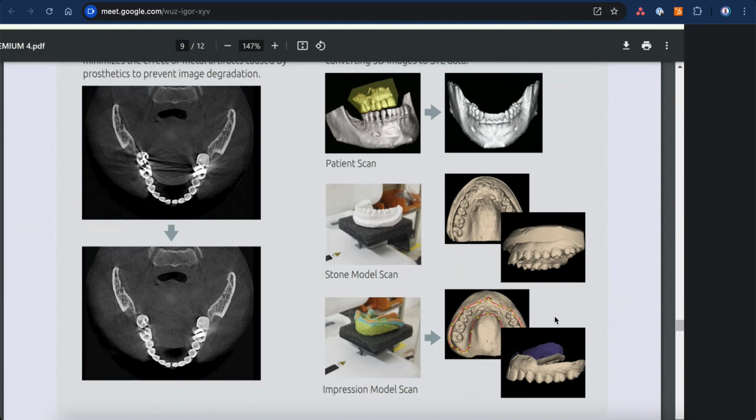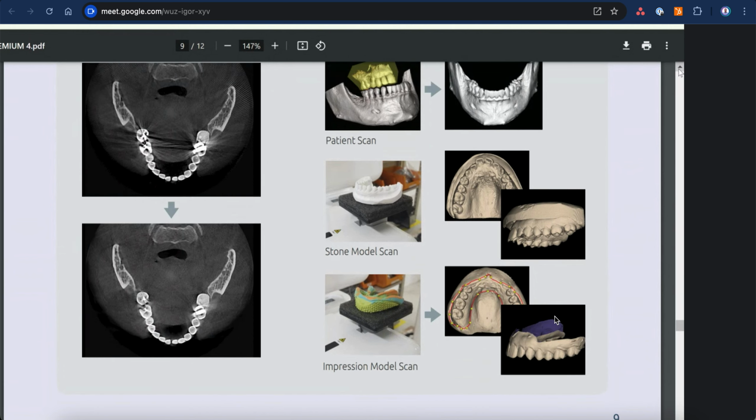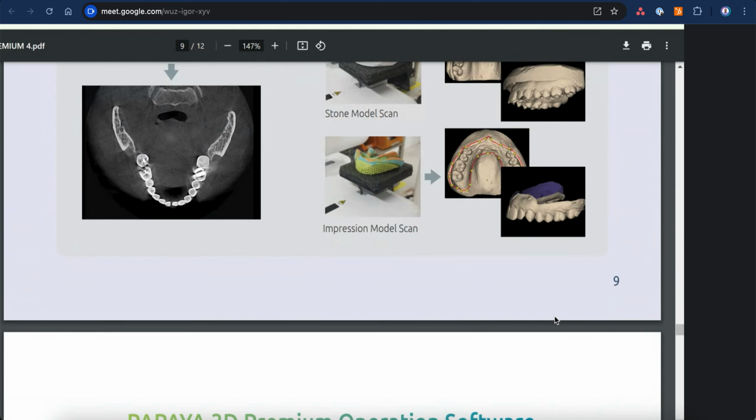So, doctor, the zircon types, they don't cause this metal artifact? No, zircon, no, because it's not metal. Zircon is more like a glass. Yeah, because it's essentially made from glass. It's only the porcelain, because it has a metal base.